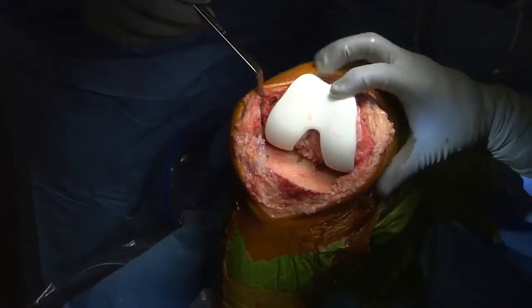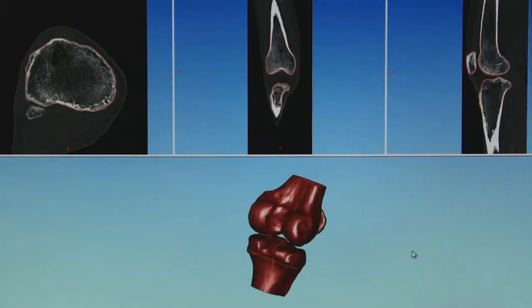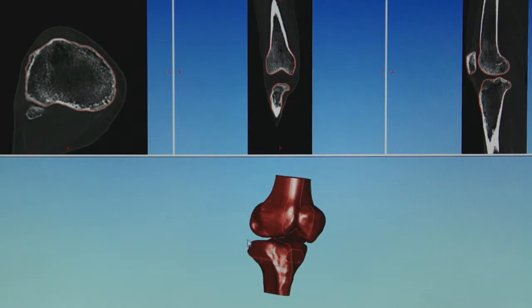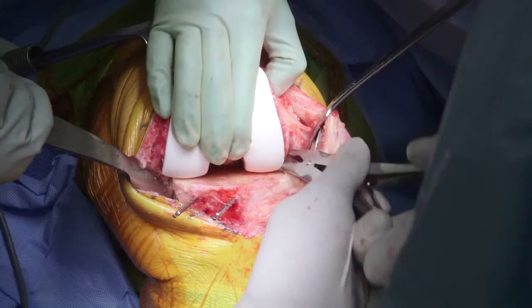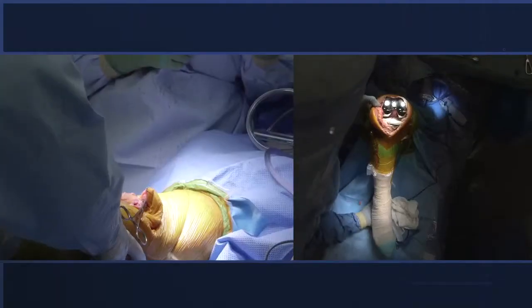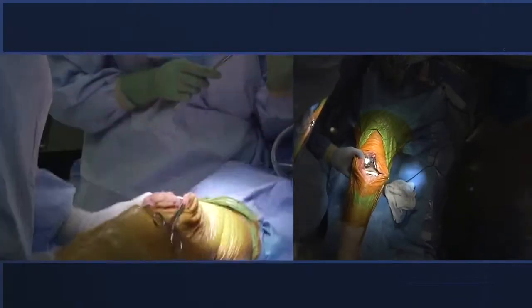When you look at ConforMIS, we do not see overhang, we do not see underhang because it's been matched prior to surgery with the imaging technology that they use. And you could really tell where the osteophytes were because they were the extra bone that was outside of where it was supposed to be, and once you trim the osteophytes off, all of a sudden the knees just started working like a normal knee. And it was pretty impressive.